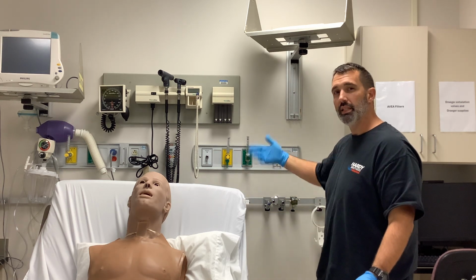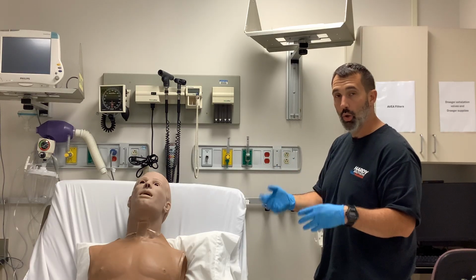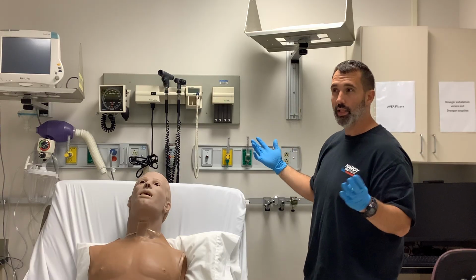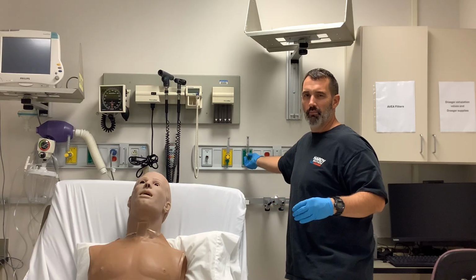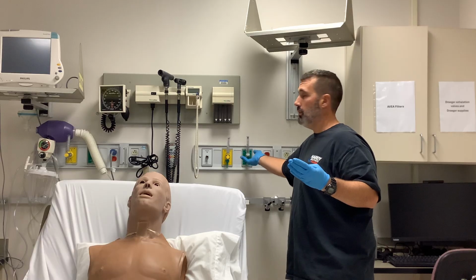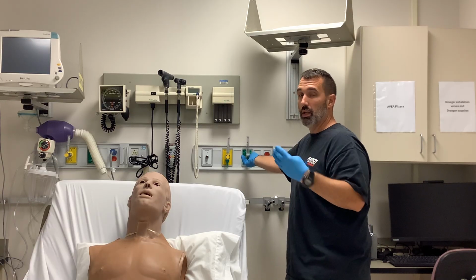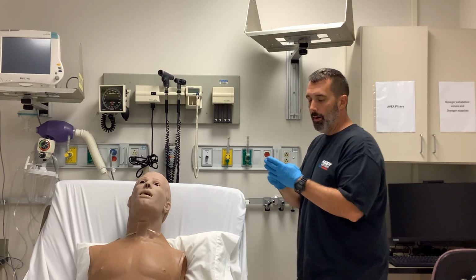You can hear the intensity behind that. Can that flow meter put out more than 15 liters per minute of flow? It certainly can. We're only calibrated to 15 liters per minute, so we don't really know what it is. Let me just listen to the change. So it does put out more than 15 liters per minute of flow. However, above 15, because it's only calibrated to 15, we don't really quite know.